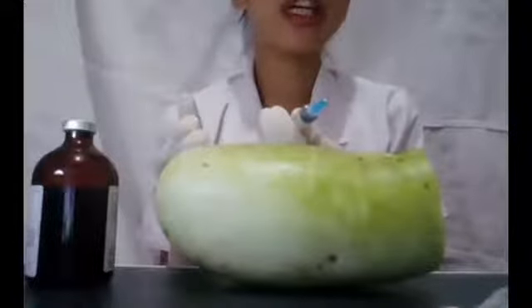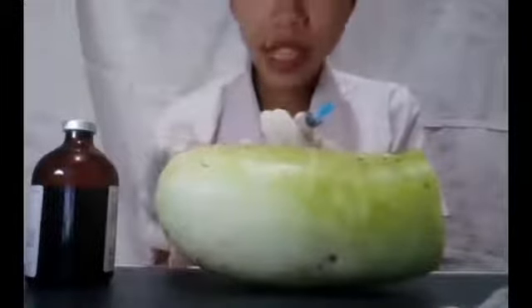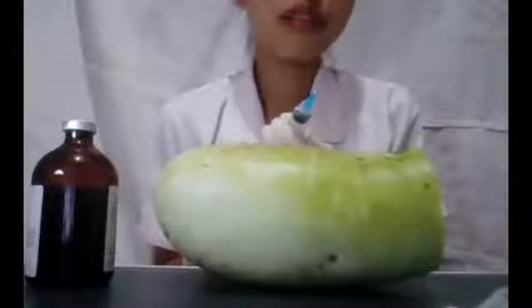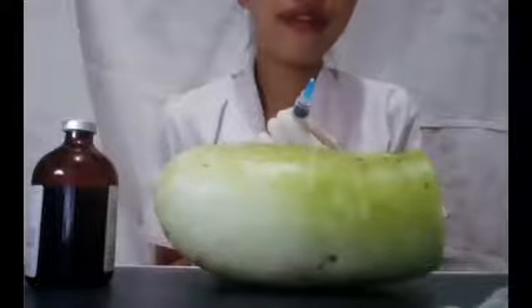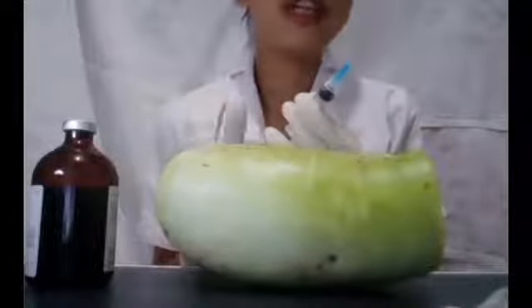So before we draw up from the vial, we need to instill air into the vial. So let's say that our medication record states we're giving 0.5 ml. So 0.5. So now we're ready to inject air into the vial.